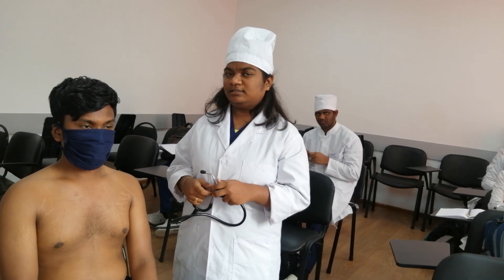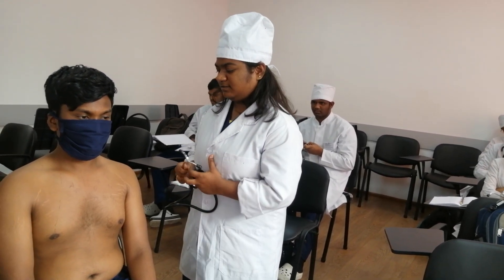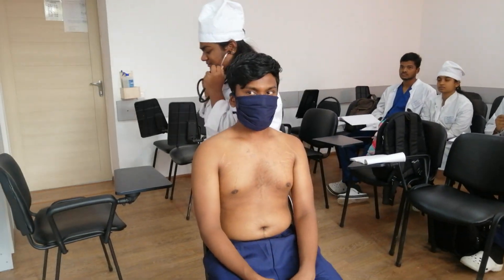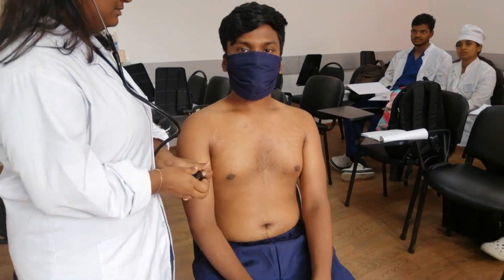Second point: in the second intercostal space, there is the aortic valve — which side? Right side. Listen from the right side; stand on the right side of the patient and listen.